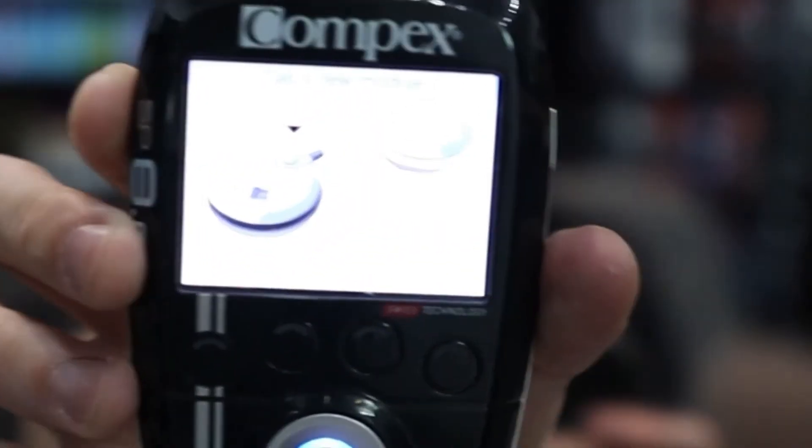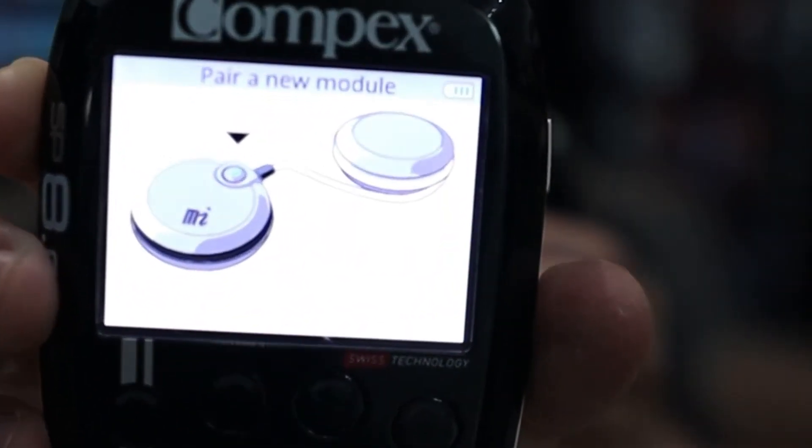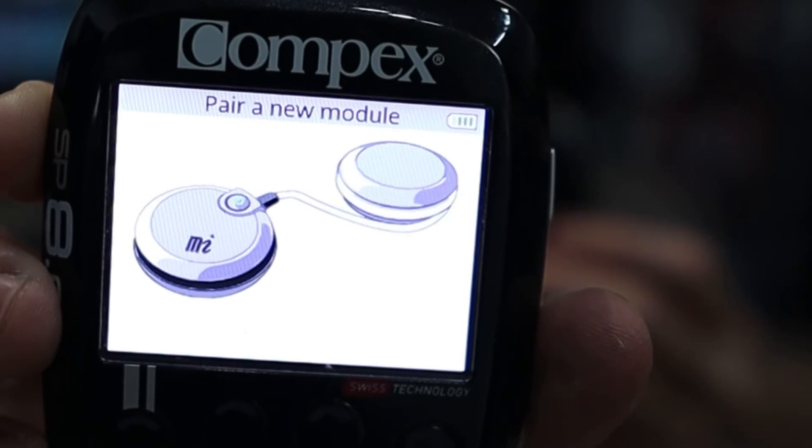Let me just show you. This particular module has already been paired, but this time round we will pair it again. And yes, it has been paired this way.